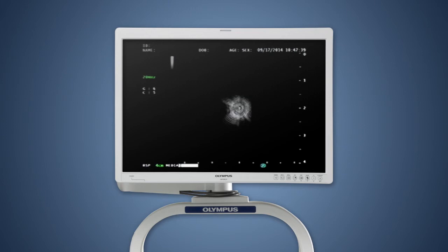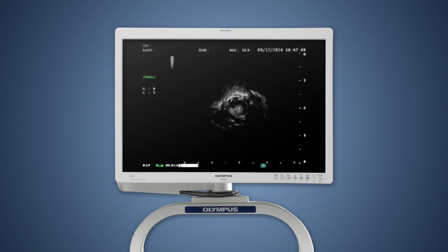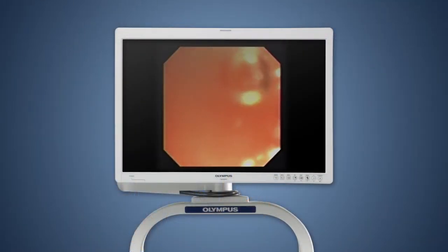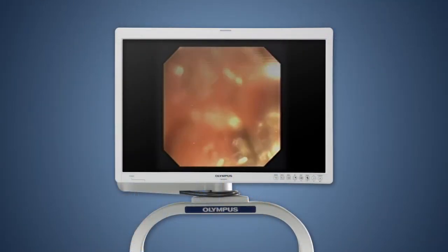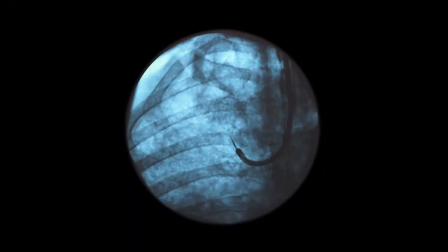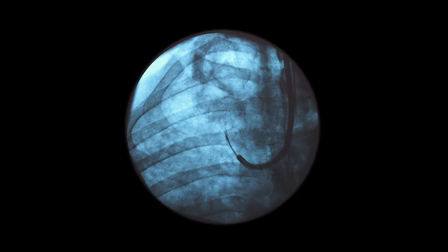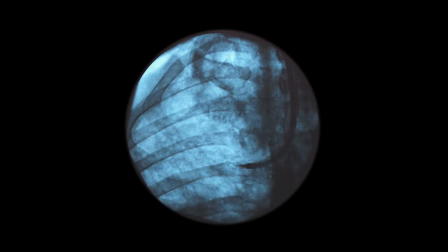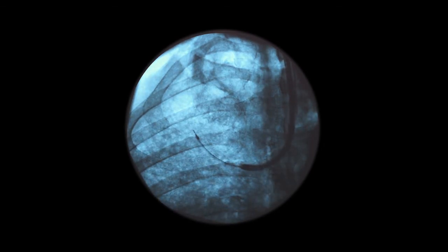If the lesion cannot be found initially using this technique, the smaller caliber bronchoscope may be used to direct the radial probe into alternate airways, either endoscopically and/or with fluoroscopic guidance. The benefit in this scenario is that the smaller caliber bronchoscope may be directed without requiring the directional curette for pulmonary nodules that are more medially located. It is important to note that when performing peripheral bronchoscopy with radial ebus, biopsies are not performed with continuous ultrasound guidance as they are with the curvilinear ebus TBNA system — the radial probe must be withdrawn first before a biopsy is performed.